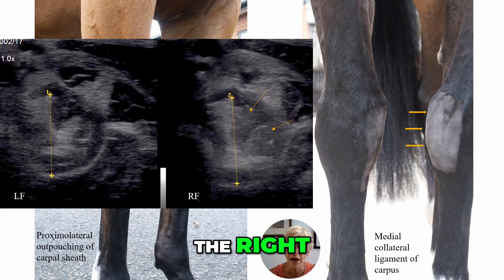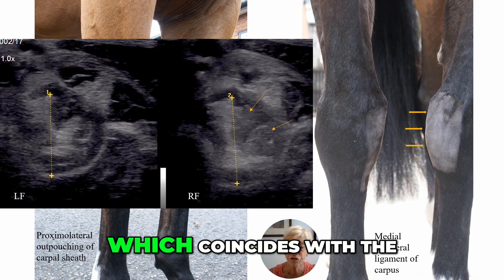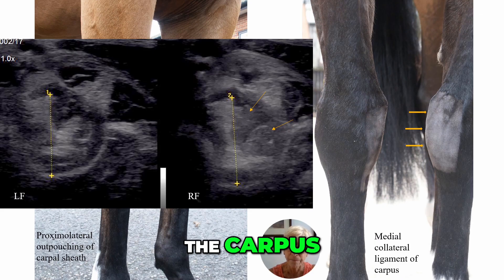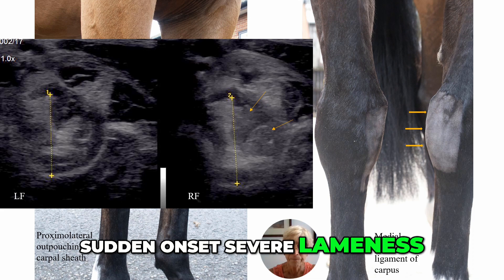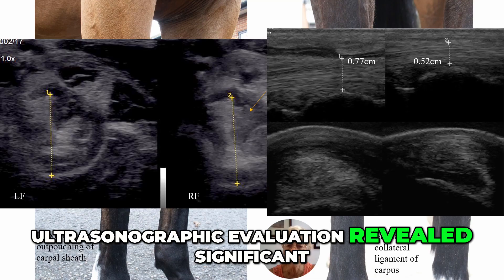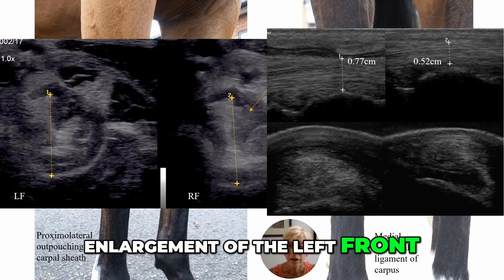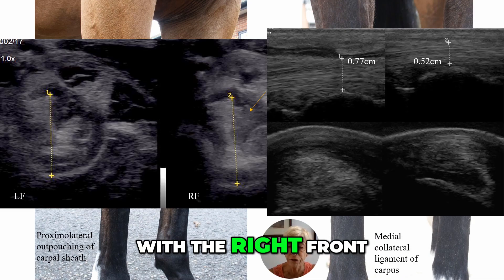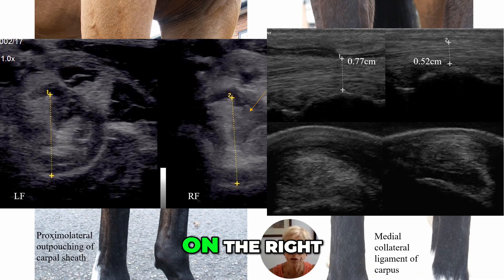In the horse on the right, we have swelling over the medial aspect of the carpus, which coincides with the medial collateral ligament of the carpus. This horse had a sudden onset severe lameness of the left forelimb. Ultrasonographic evaluation revealed significant enlargement of the left front medial collateral ligament of the carpus compared with the right front. The left front images are on the left and the right front on the right.